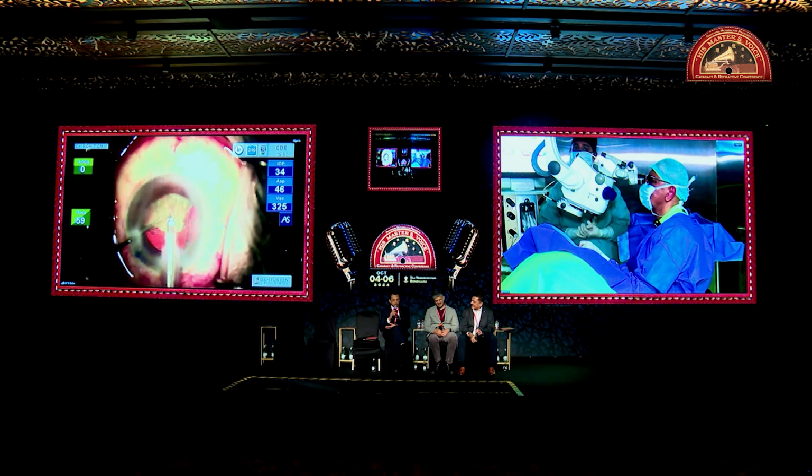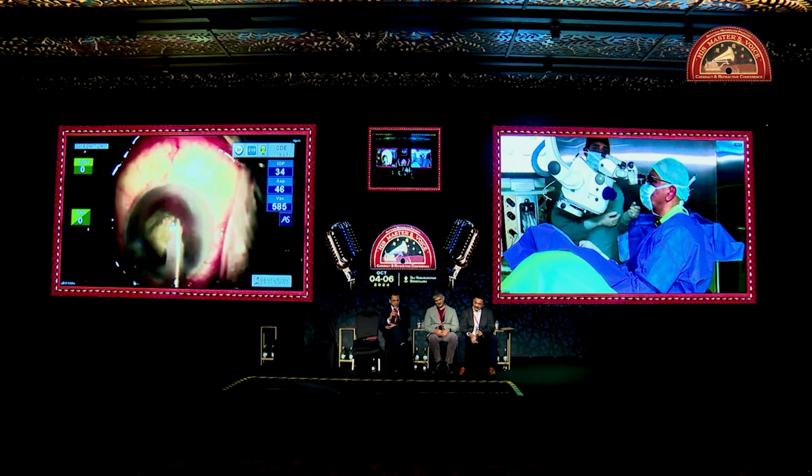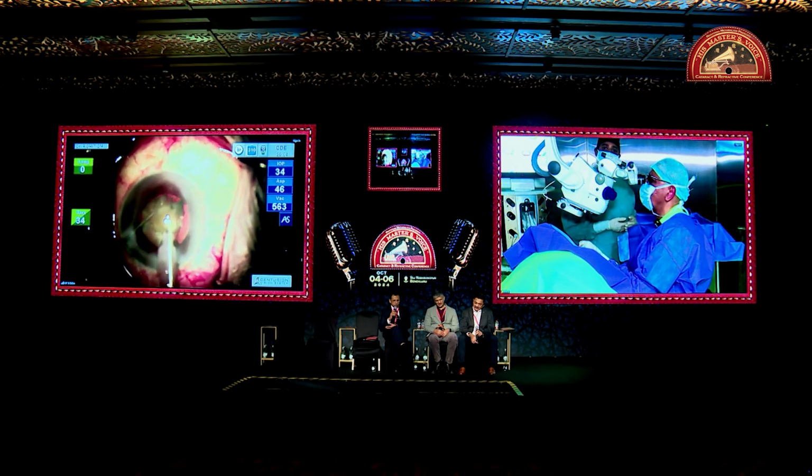Sir, would you consider replenishing some OVD there at this stage, because it's a very dense cataract? I'll use the chopper. I'll use the epinucleus as a shield. Okay.